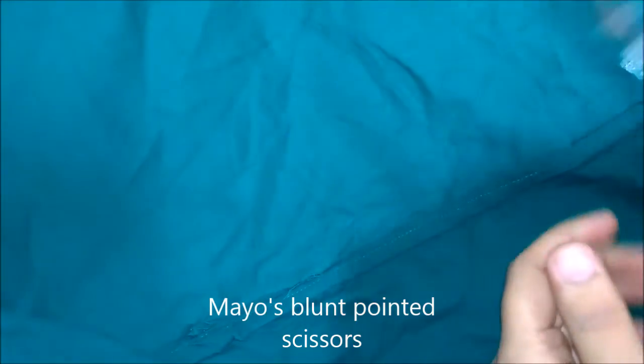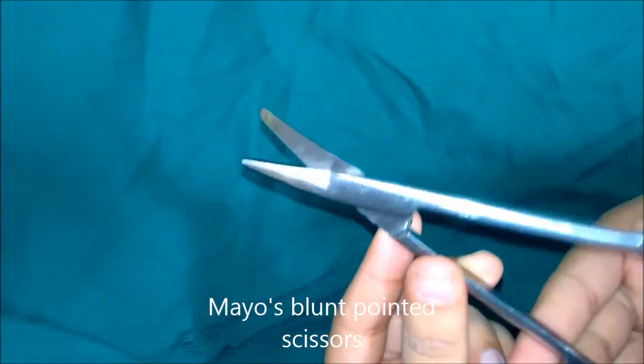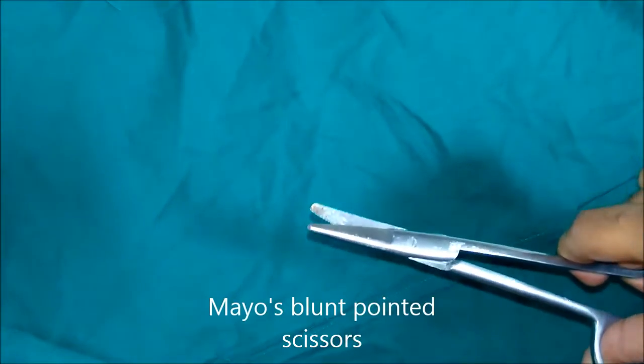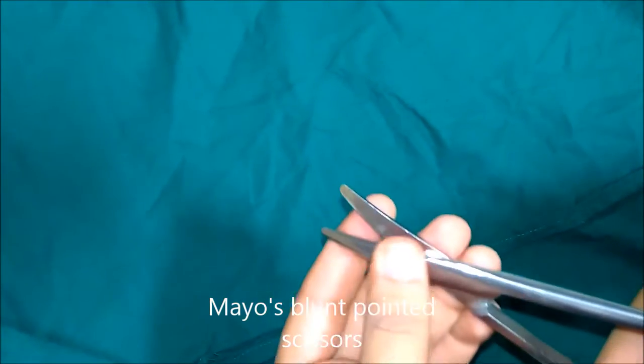This is Mayo's blunt pointed scissors. It can be used for cutting sutures or dressings, or it can be used during appendicectomy to split the internal oblique and transversus abdominis muscle, or it can be used to cut tough structures like linea alba or external oblique aponeurosis.